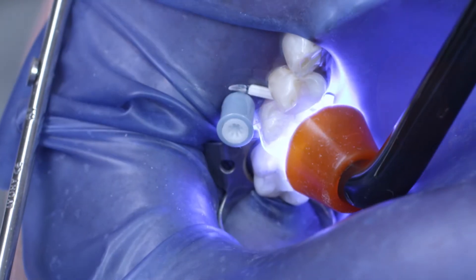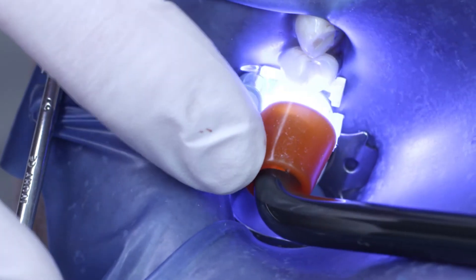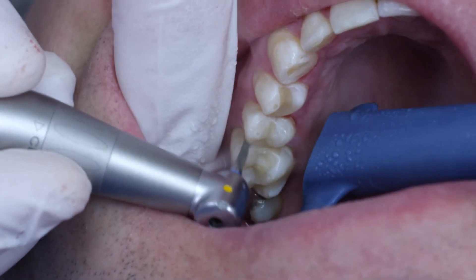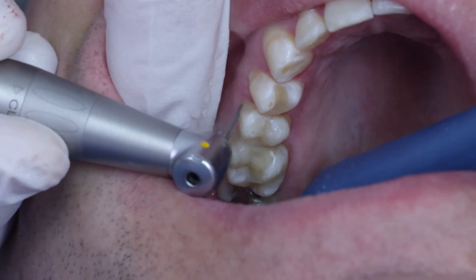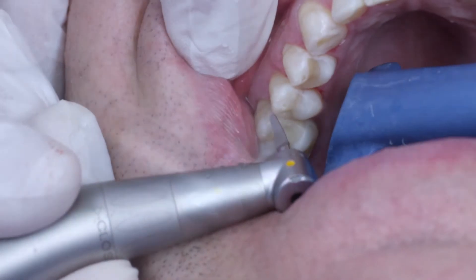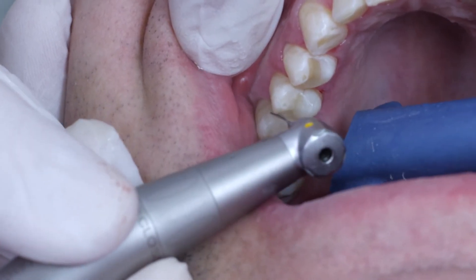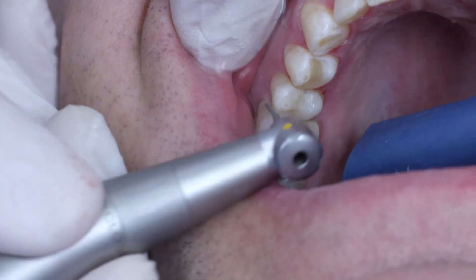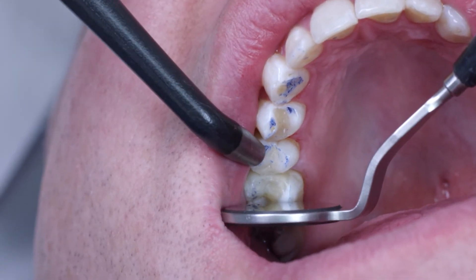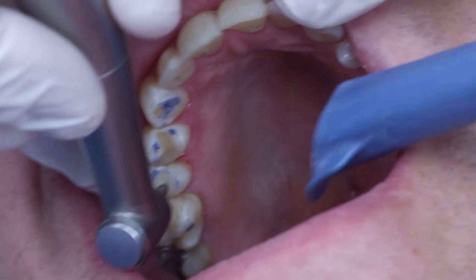Here you can see the final restoration, which was cured thoroughly once again from all sides. Once the rubber dam was removed, the tooth could be finished in its entirety. I used an oscillating diamond file ideal for processing the buccal contour, and the occlusion was verified and adapted using a lens-shaped diamond tool.